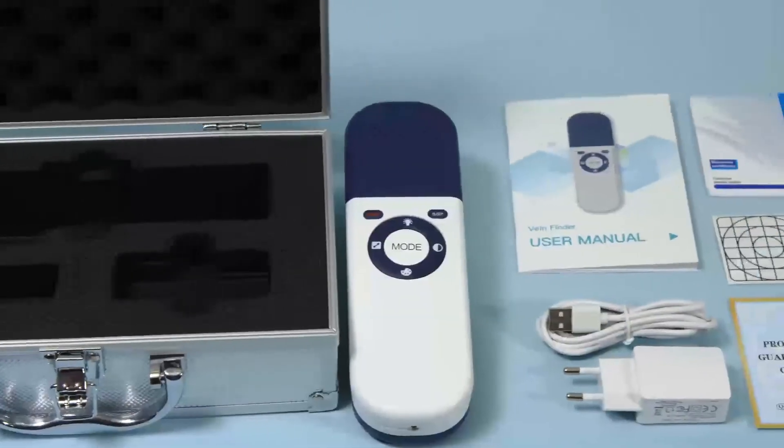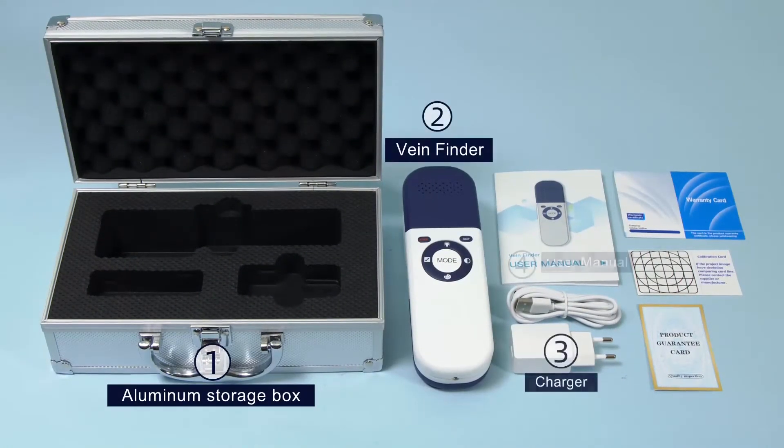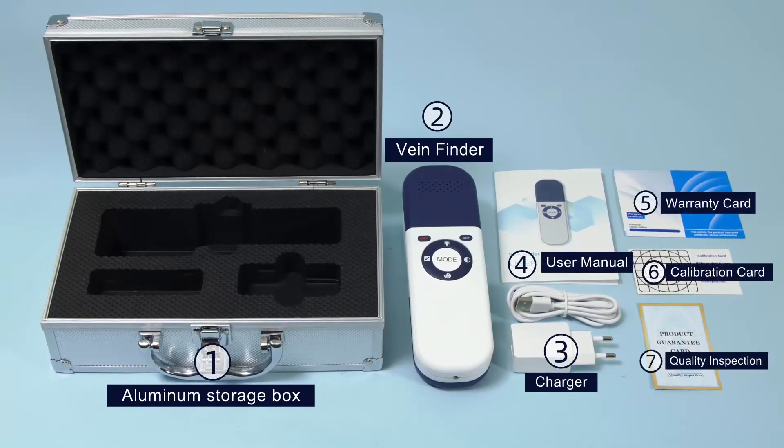The standard configuration of the product consists of an aluminum storage box, VeinFinder, and charger, etc.